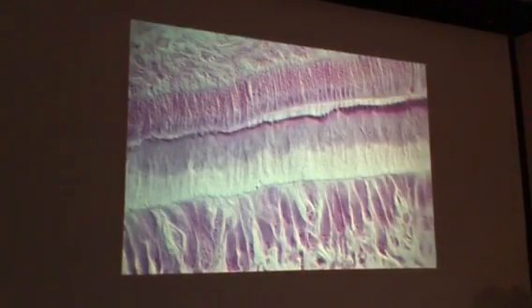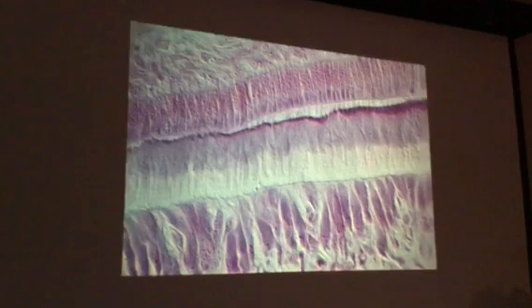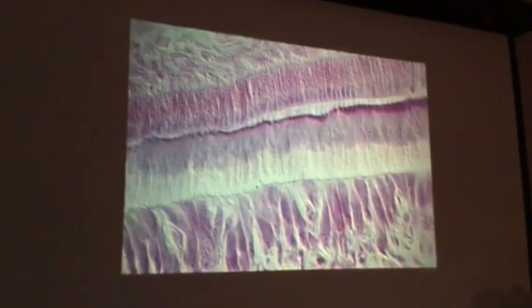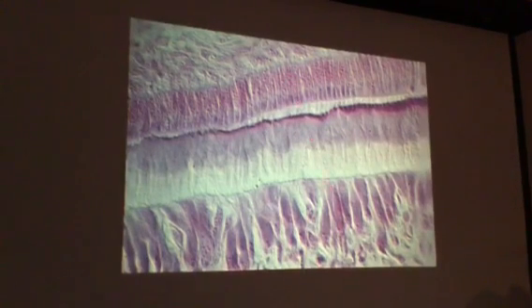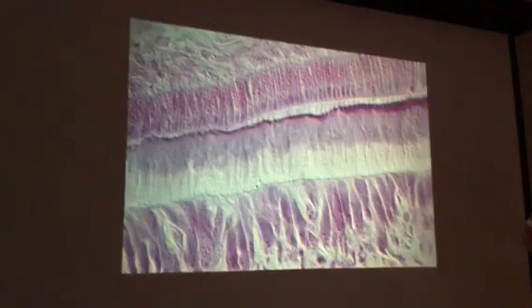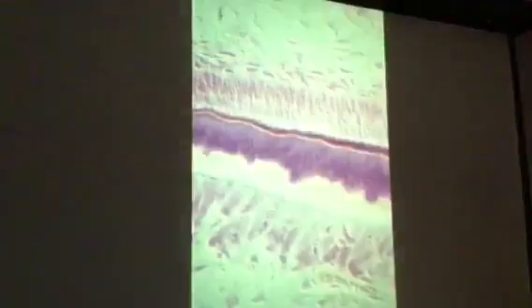Okay, and now nice odontoblastic process sitting right in a dentinal tubule. You can see some of the canaliculi coming across, more ameloblasts, and we also have some odontoblasts. Why are those basophilic? You know, ribosomes, they're secreting collagen.